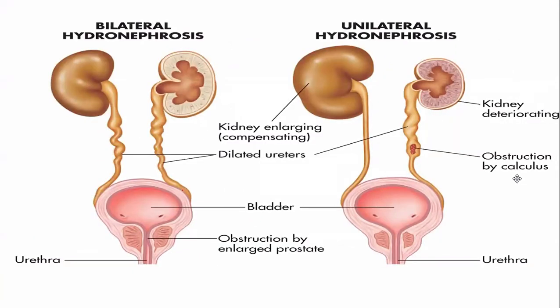So, for example, you have a problem here. Look at that, you will have a dilatation. At first, it is important to know that there could be an enlargement of the kidney. Yes, correct, because if you fill it with water, you can enlarge the kidney. But later on, don't be surprised, you will have a hydronephrotic kidney filled with urine, but the kidney becomes small.